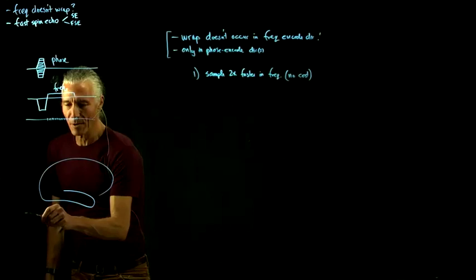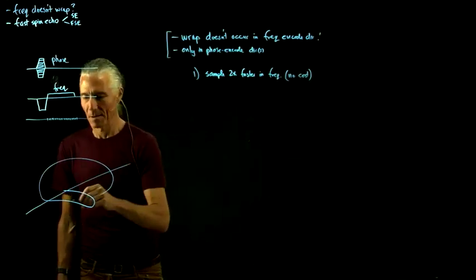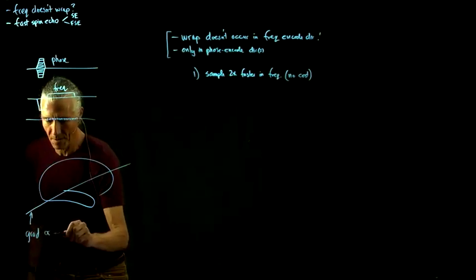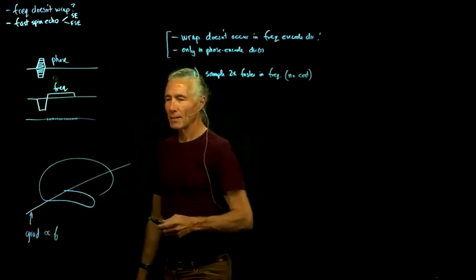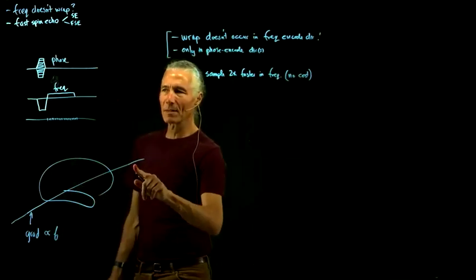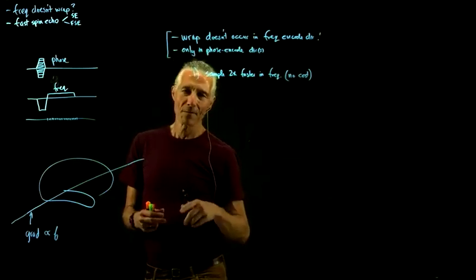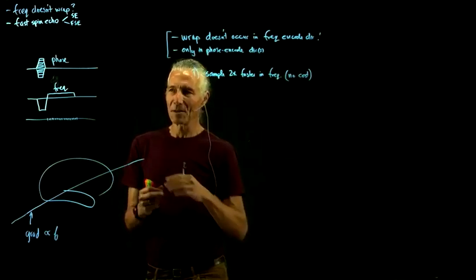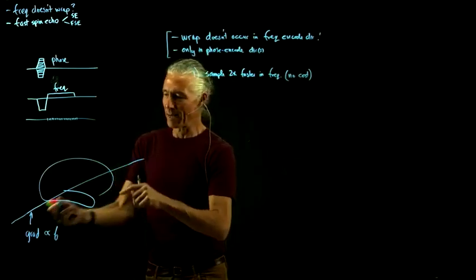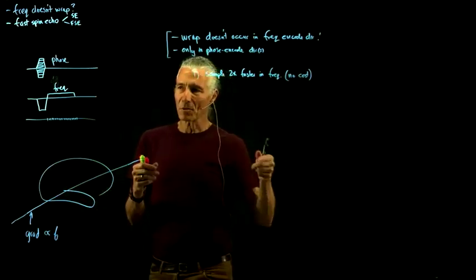say we put a gradient on, from front to back. So here's our gradient. Then basically that's going to be proportional to the precession frequency. That means that at this point the precession frequency is going to be higher, and going to be lower over here. So one thing we can do is take the signal that we get out, which has all these different frequencies in it, which I said don't think of it that way, but it does. That's what's causing the phase wraps to occur. The fact that spins at this end of the gradient are ahead and spins at this end of the gradient are behind. That's what's actually causing those little stripes of spin phase to occur.